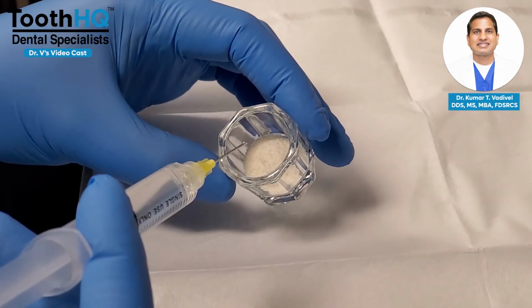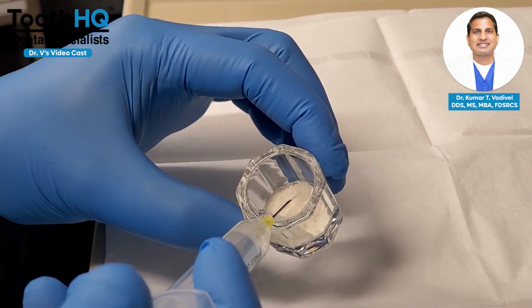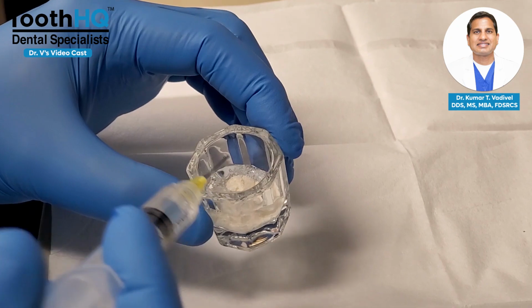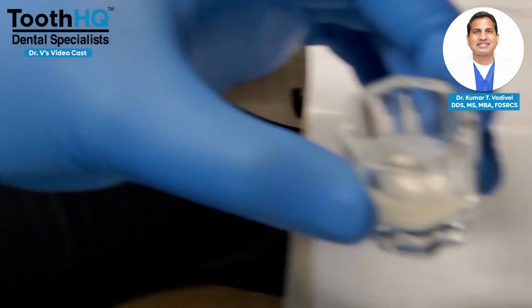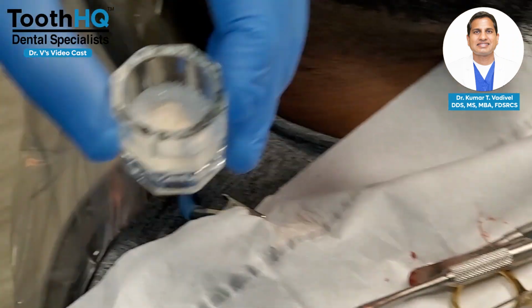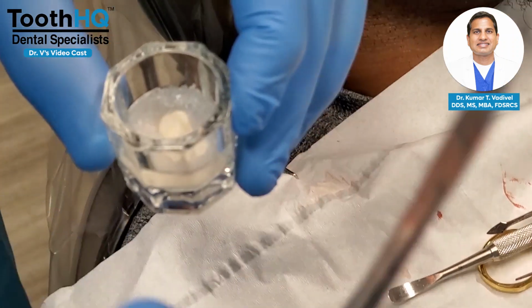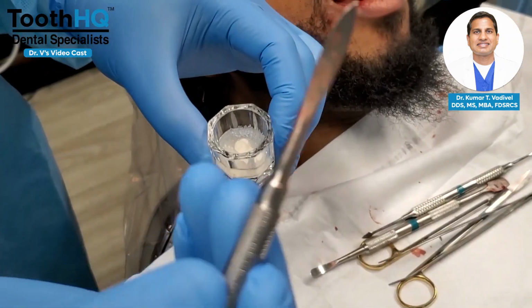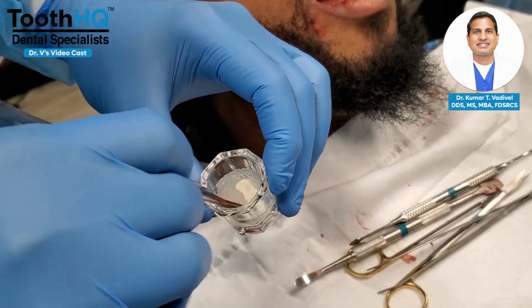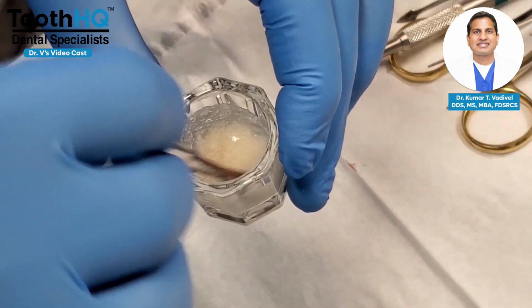So all you've got to do is get your dappen dish, a clean and sterile dappen dish, and I'm going to put the water here. And we call this a Buser elevator. But any Buser, or I'm sure you guys have a Molt periodontal elevator, the Molt periodontal elevator is going to work also. All you've got to do is mix it like this.